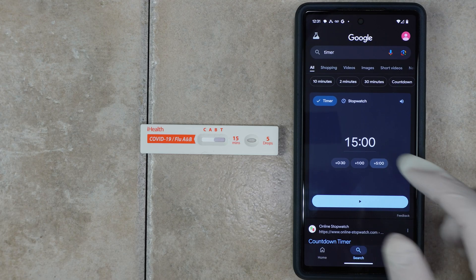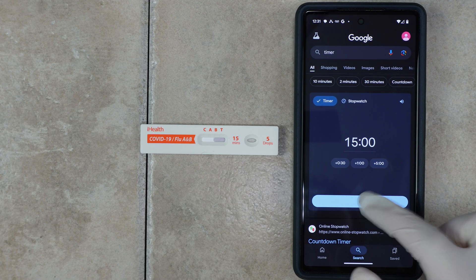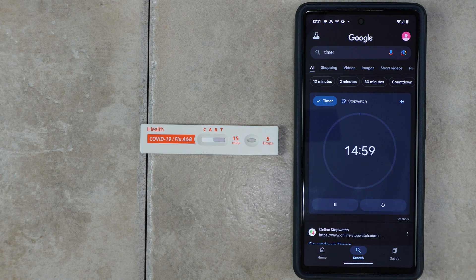Once you've got the five drops in there, you have to wait 15 minutes. If you lose track of time and it ends up being 30 minutes, you cannot use the results.